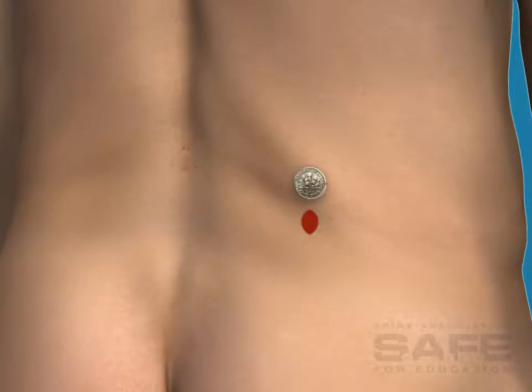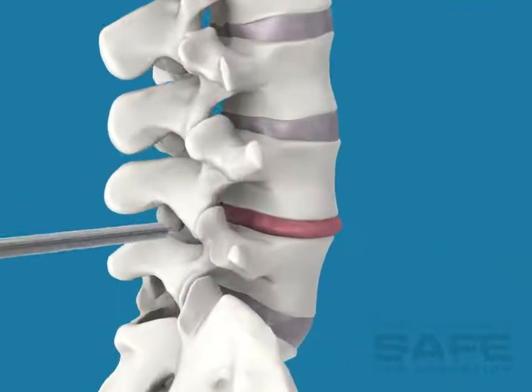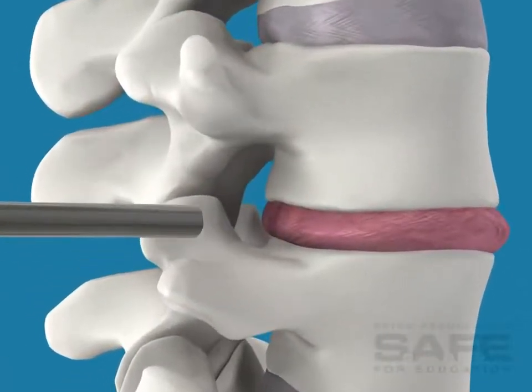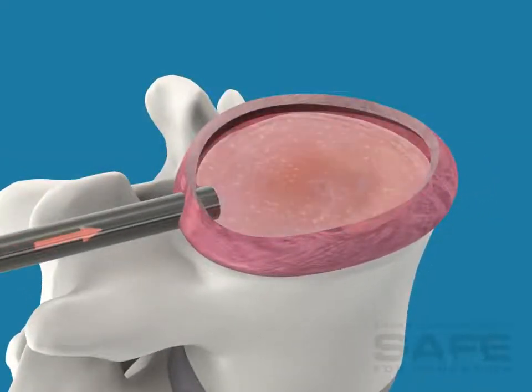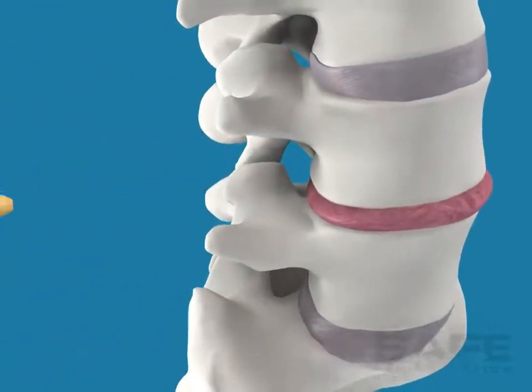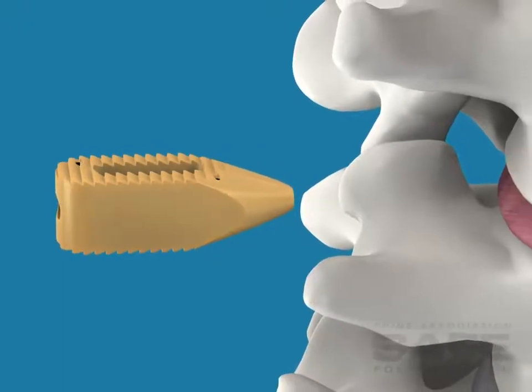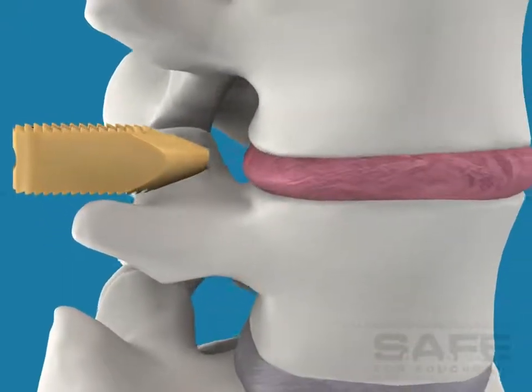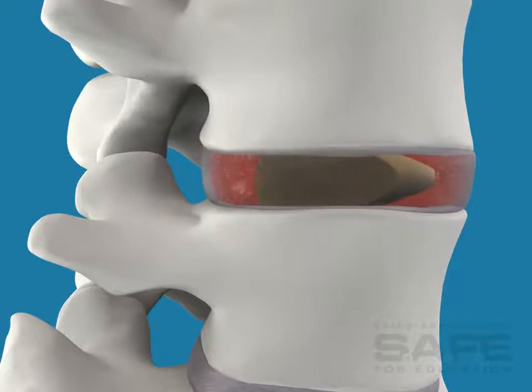That's smaller than a dime. First, the diseased disc is removed through a small portal that protects the skin, muscles, and nerves. After the disc is prepared and the bone graft material is placed, a biocompatible polymer implant is positioned in the disc space.